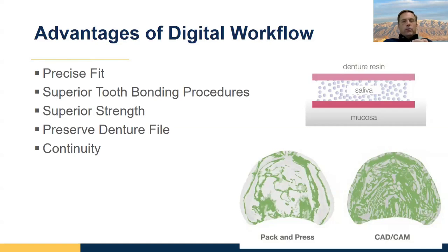A tooth can move during processing. You might get something that cracks. You might get a piece that gets chipped when we're devesting. I mean, obviously in the lab, we're trying to pay attention and do a good job, but processing acrylic dentures can be kind of a high force process. Like we talked about, you have the pour technique, which helps with that.